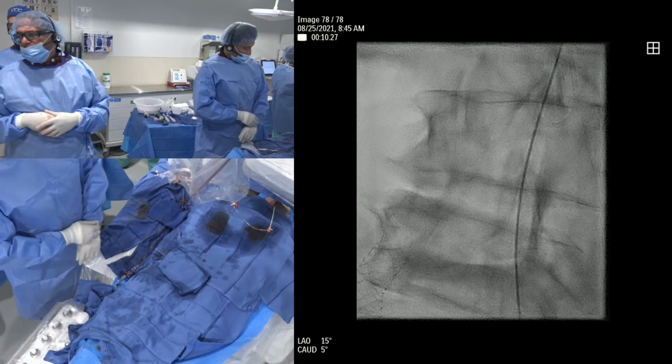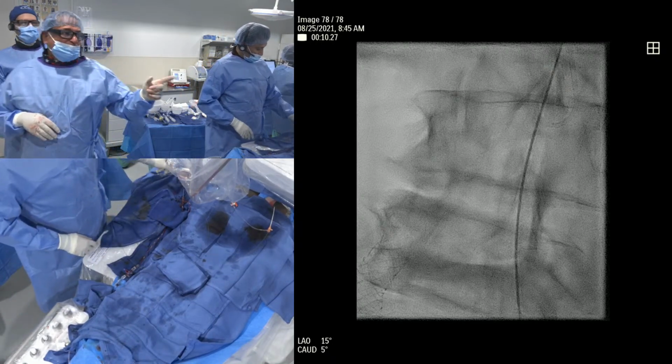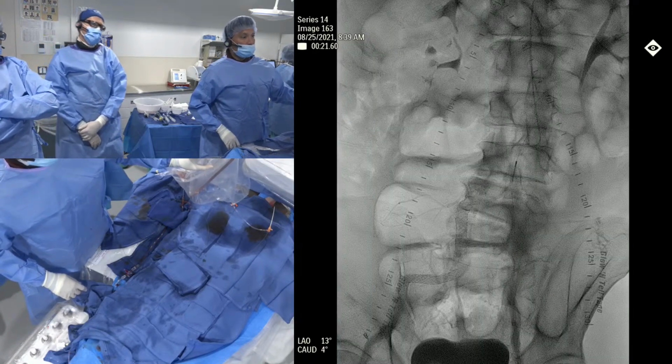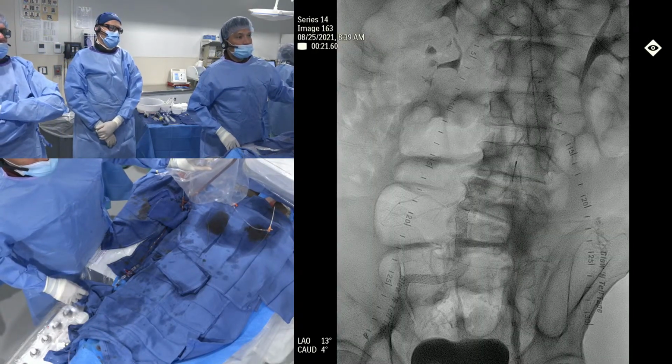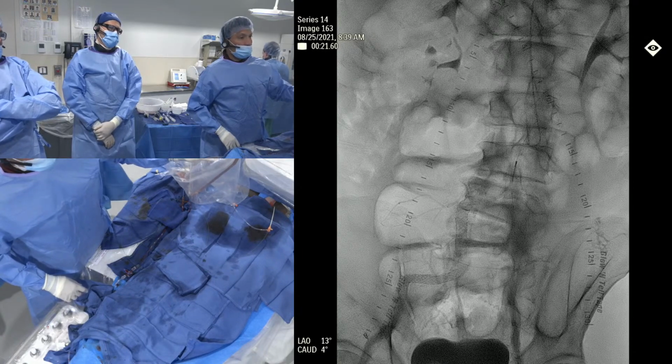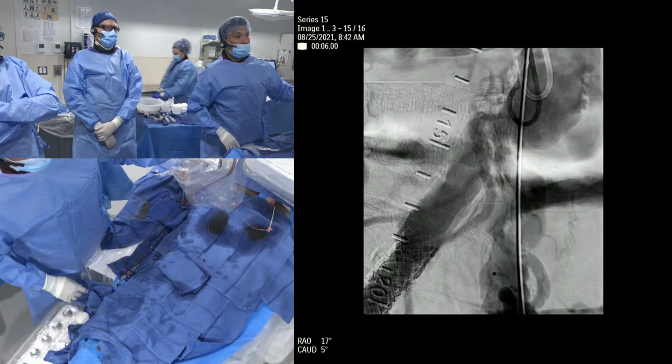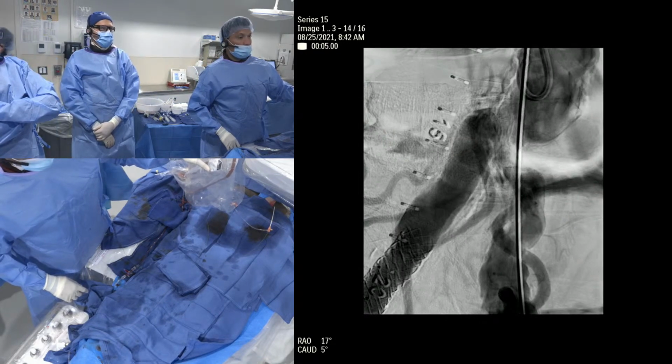7.0. What do you have? So after the iliac angio, show me the first shot. One of the things you also want to look at is what is the status of the internal iliacs? Because obviously you can go with a much larger stent here and just come across the internal iliacs if you don't have anything to worry about.